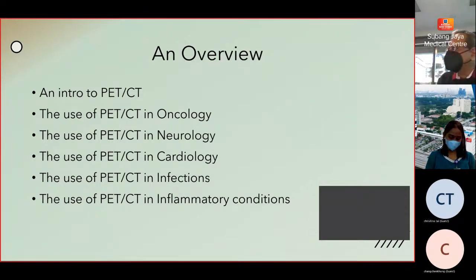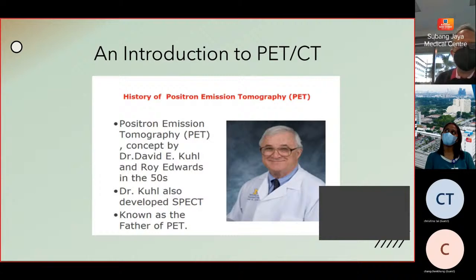Now, as you know, the bulk of the use of PET CTs is in the area of oncology, but more and more now we are using it for other conditions. I just want to talk a little bit longer on oncology, and then I shall touch on the other aspects of usage of PET CT. So before we proceed, a brief history of positron emission tomography. That's what PET stands for.